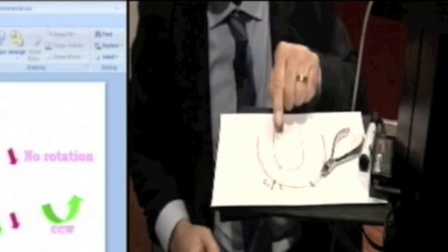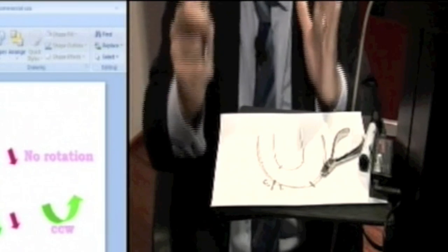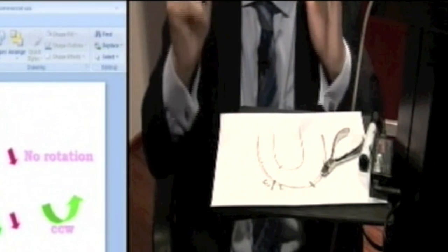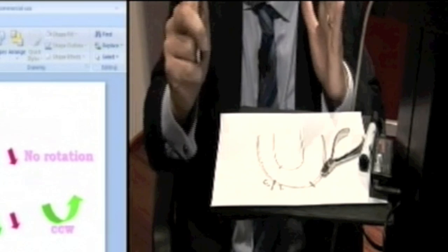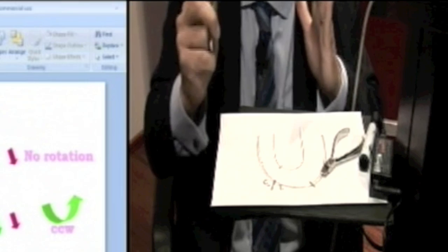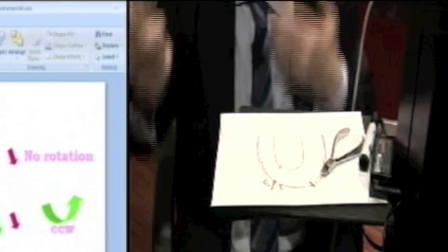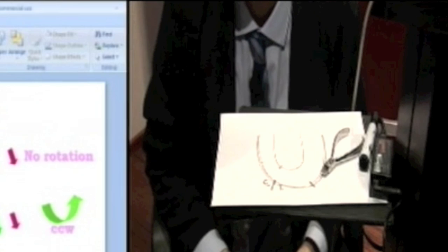So the bends at the end are to visualize the torque. When you finish doing this exercise, the goalpost should be upright, because that shows zero torque. If they're leaning in or out, you introduced unwanted torque.